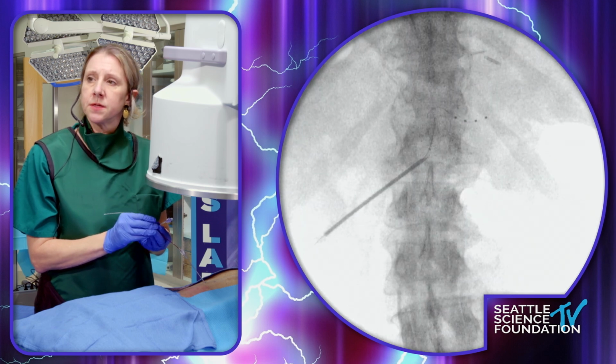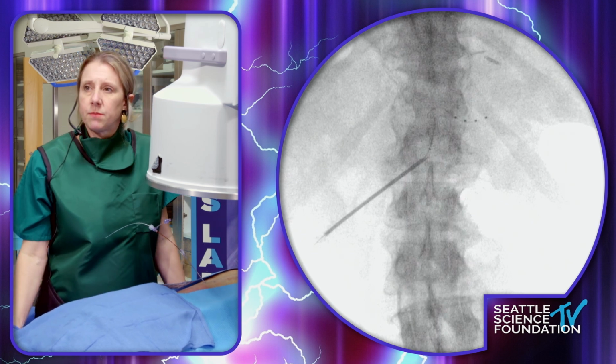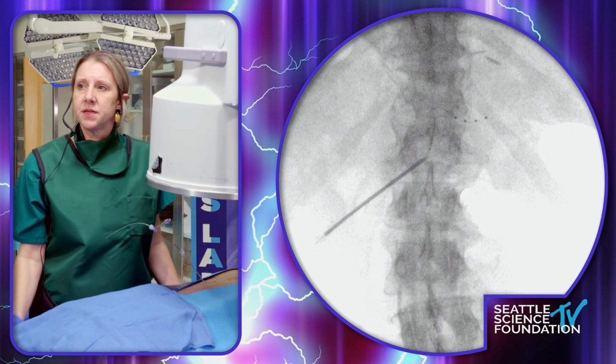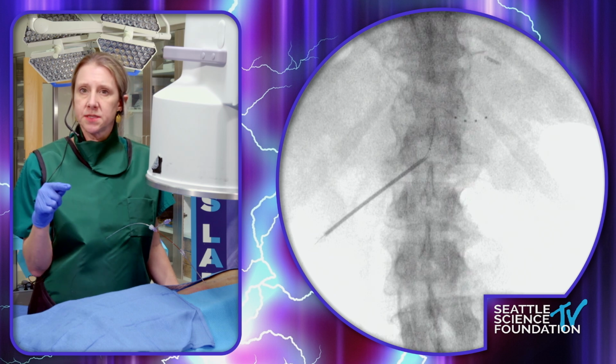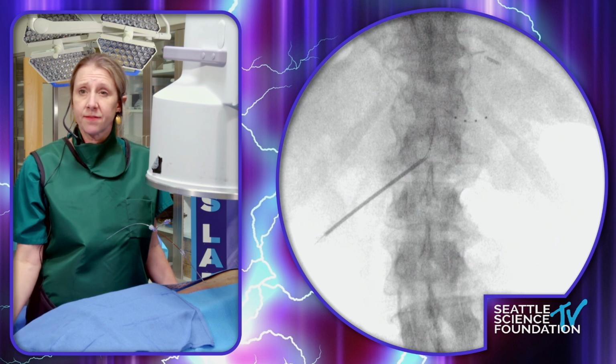Stop. So you can see it's taking some troubleshooting for me to create the strain release loops in the posterior epidural space. And this is part of the procedure. This is really characteristic. Everyone is a little different.